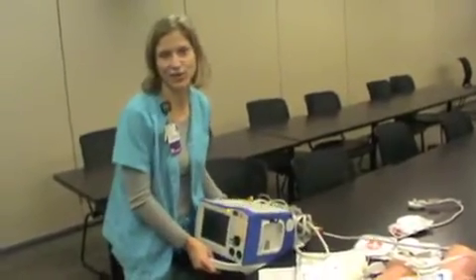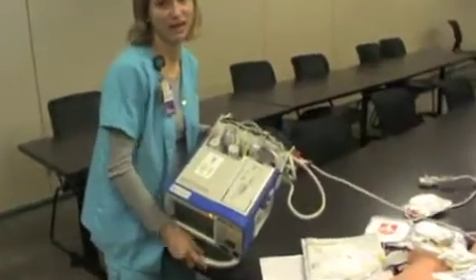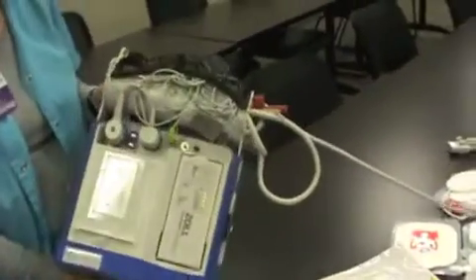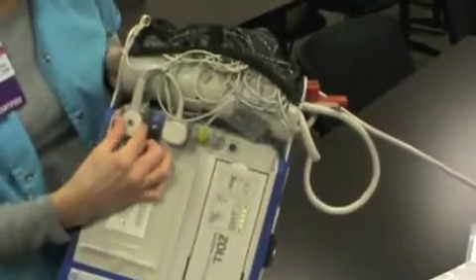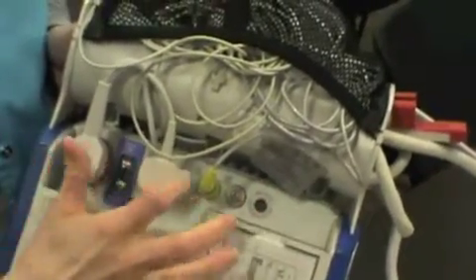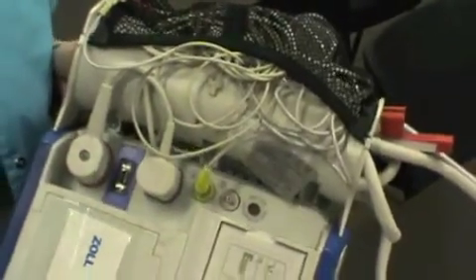Hey, this is our new Zoll R Series defibrillator, and we're giving you a quick in-service via video. So, quick overview of our new defibrillator. On the top here, you'll notice 3 cords. This one is the one that delivers the joules. This is the EKG cable, and this is for capnography. Now these 3 cords will always stay with the machine. They're not disposable, just keep them plugged in.